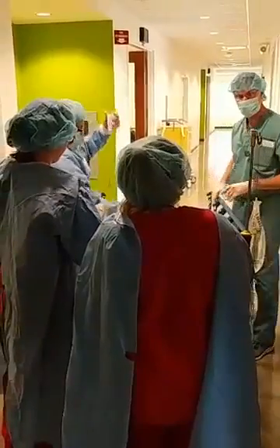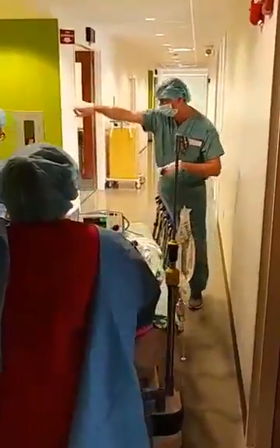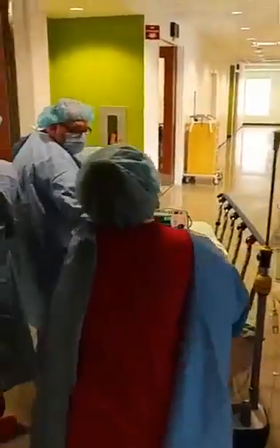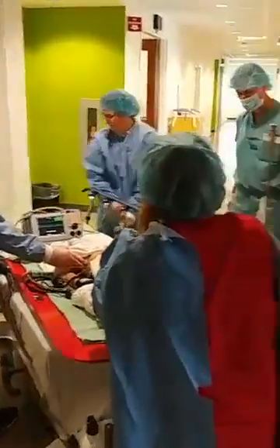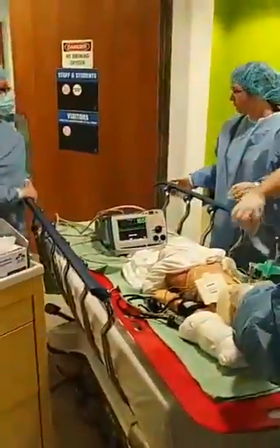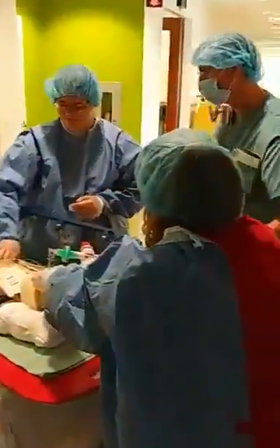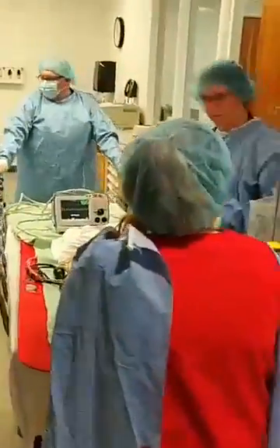Okay, guys, so we're going to roll back, and then we're going to go feet first. You have the pulse? All right, nice and easy, watch that too. How are you, Annalise? We're good. Make sure nothing gets pulled. You want to take the pulse? I'll pull a bit. You hold the pulse, let's head right in. Watch everything sterile, guys. Don't touch anything.